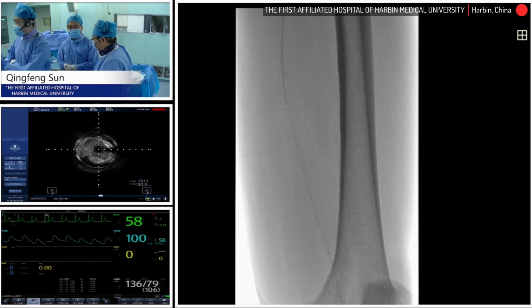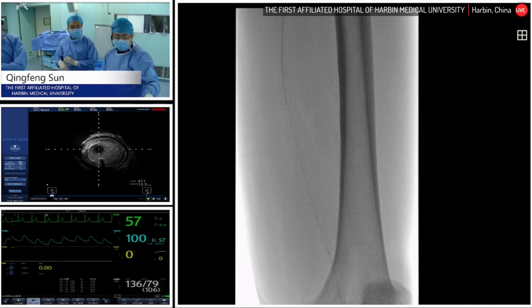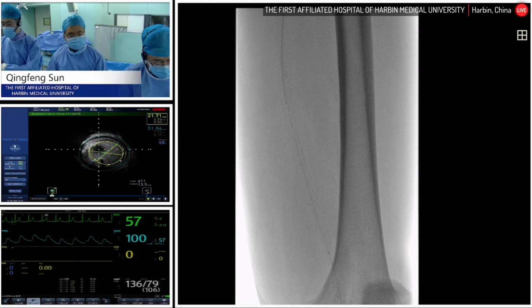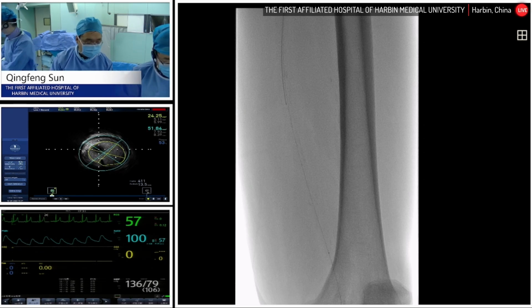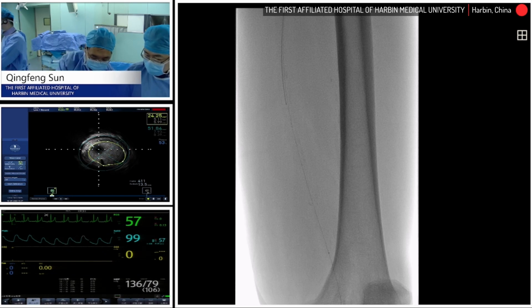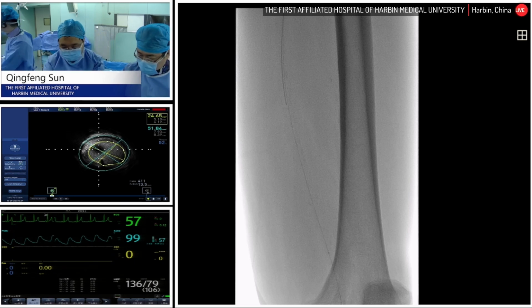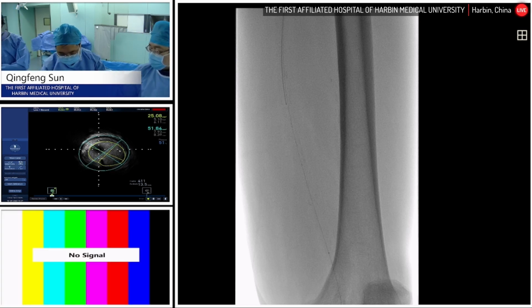We think type A and B are benign. So in this case, we are going to use DCB, and after special preparation we can see a type B dissection. From the literature, we think type A and B are quite benign dissections, but type C to F would be pretty bad. We definitely need some intervention for those dissections. But for now, we're good.